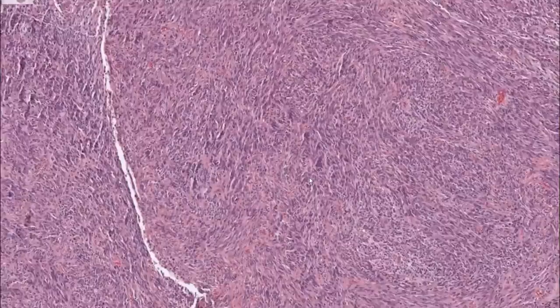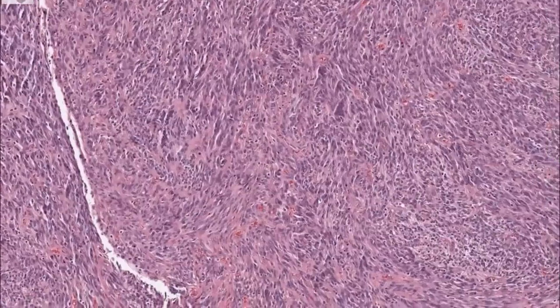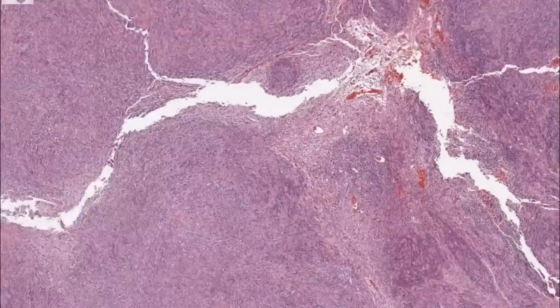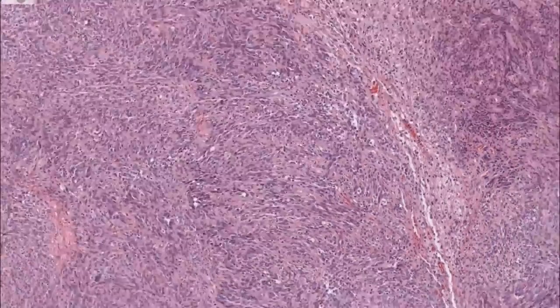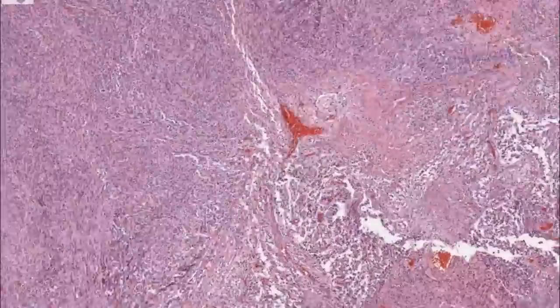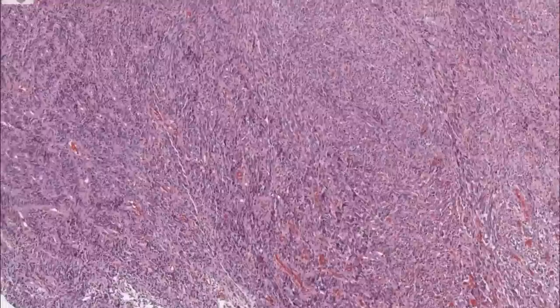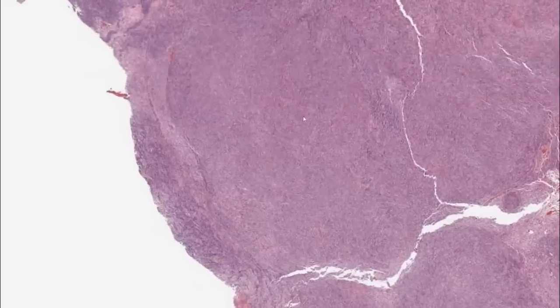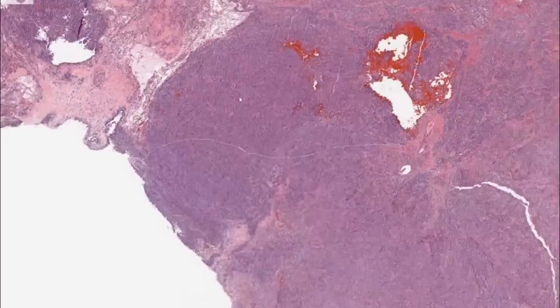Mitosis. Very spindly here, but in contrast to that tanycytic tumor, this one is much more cellular and very proliferative. You have areas with pseudorosettes here. Some nodules here of ependymal tumor. And again, areas that are fairly spindly.